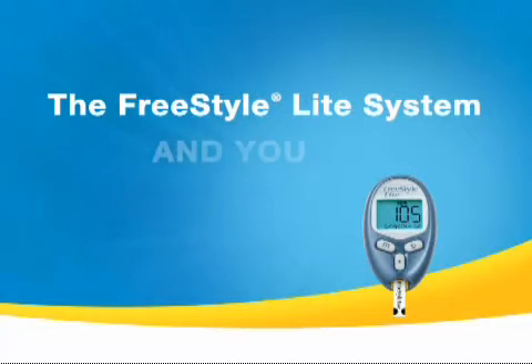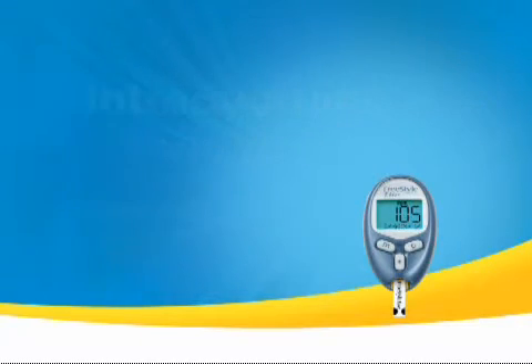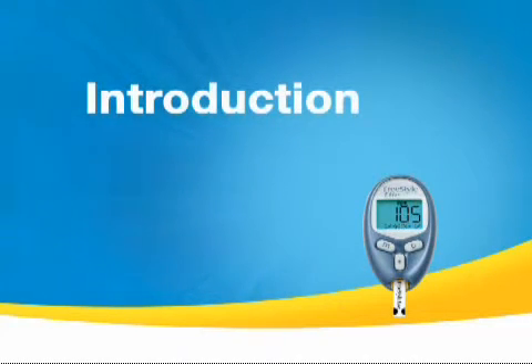The FreeStyle Lite System and you — getting to know your new FreeStyle Lite Blood Glucose Monitoring System. My name is Taylor and I'm here today to take you through the simple steps you'll need to follow in order to test your blood glucose levels with the FreeStyle Lite Blood Glucose Monitoring System.